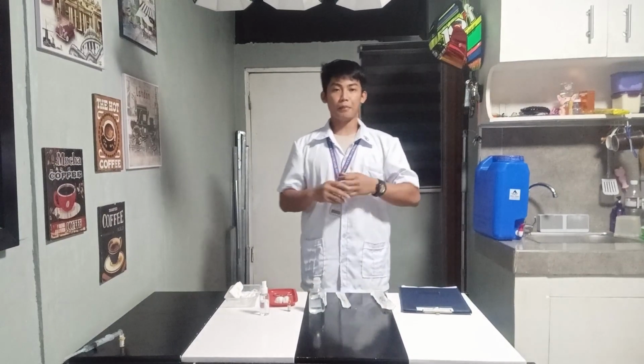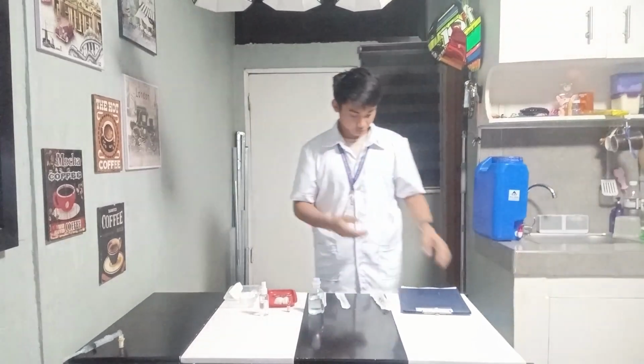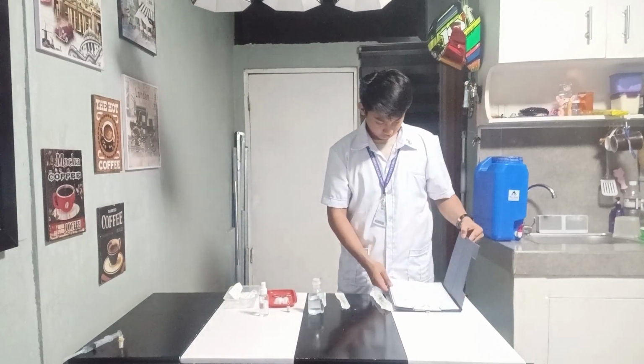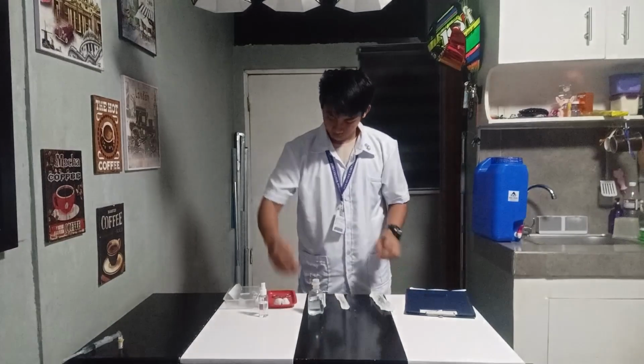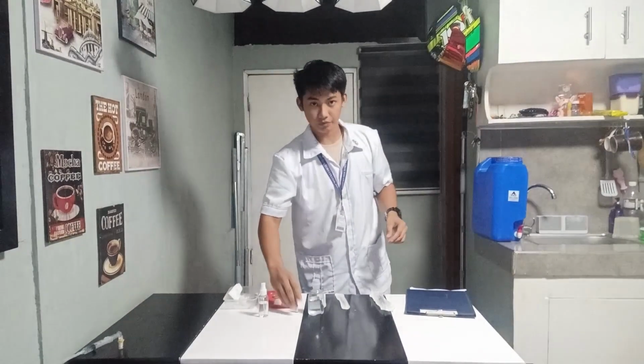Now let's prepare for the ampule withdrawal. So first we have to confirm it, paracetamol. In doing this, we need to flick its top using our fingernails to ensure that there are no air bubbles on the top, because there are instances that some medication is left on the top, so we have to ensure that there is no medication left there.